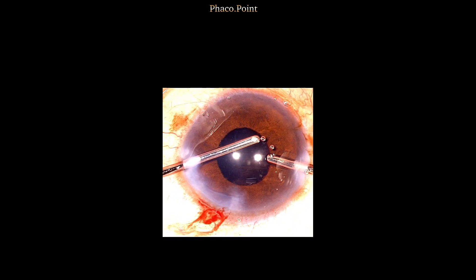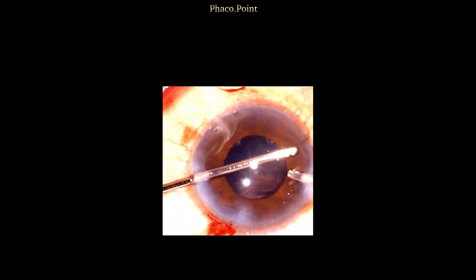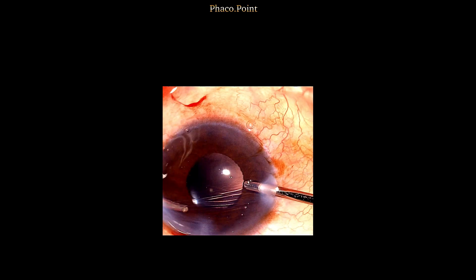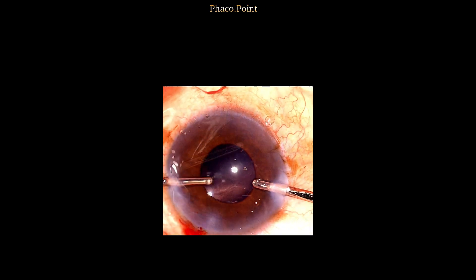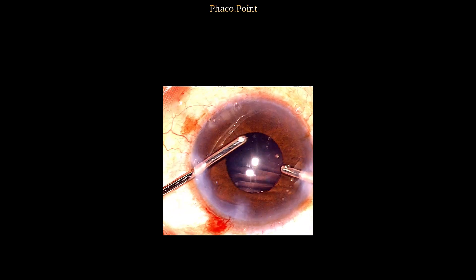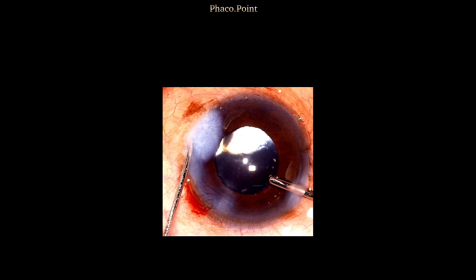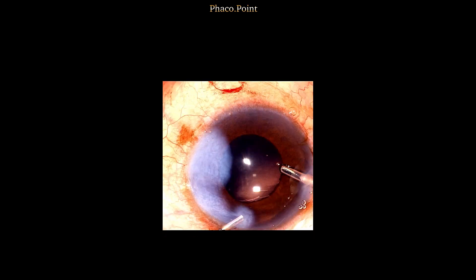Following this, the viscoelastic is then removed from the anterior chamber in its entirety. This brings us to the end of the visco wash, at the end of which each of the incisions is hydrated, getting us to the end of the surgery.